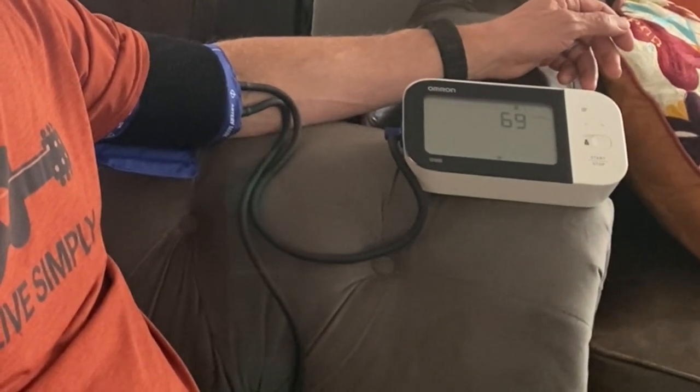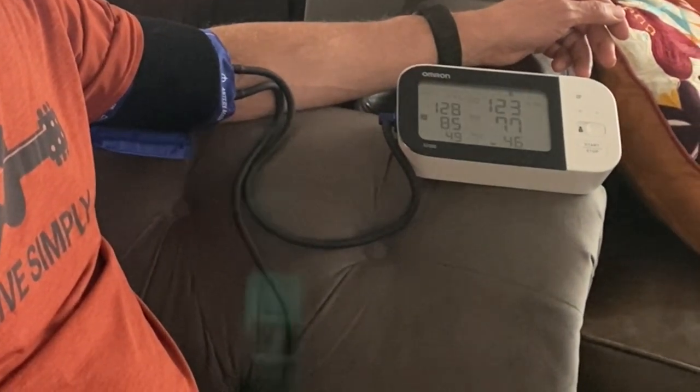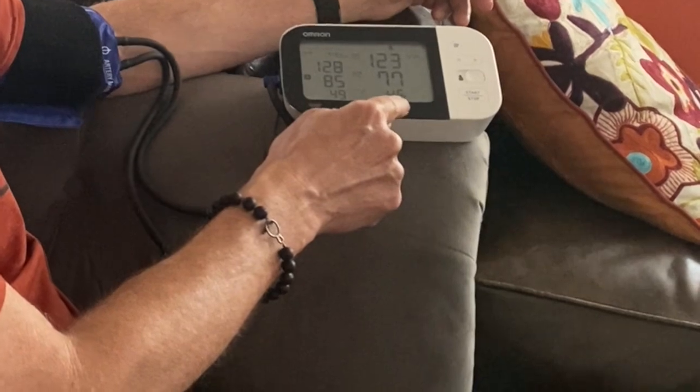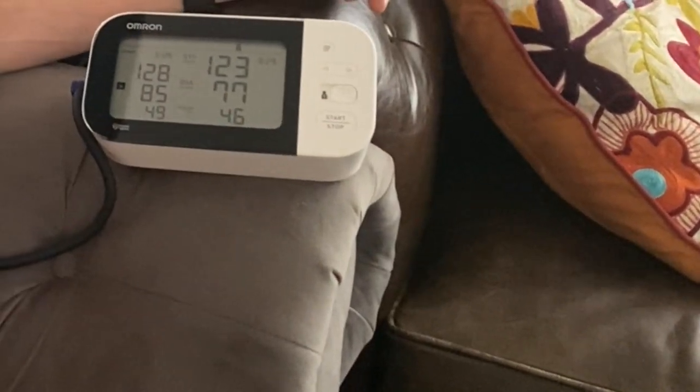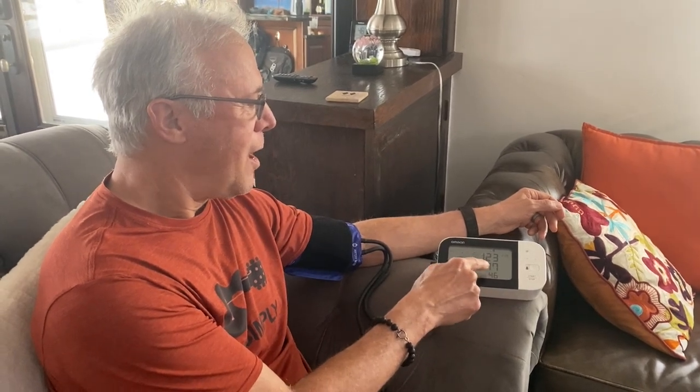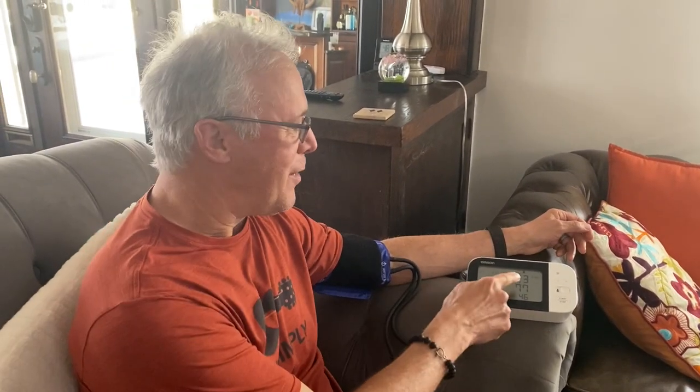Here is my reading of 123 over 77 with a pulse of 46. My resting pulse is usually very low — maybe because I've been a lifetime athlete. I'm not concerned about a low pulse. I'm very confident that this is an accurate reading: 123 over 77. Whereas if I had just used my Omron with the cuff that came with it, it probably would have been at least 10 mmHg lower on both systolic and diastolic — which sounds good, but it would be a false reading and that wouldn't really be doing me any good.